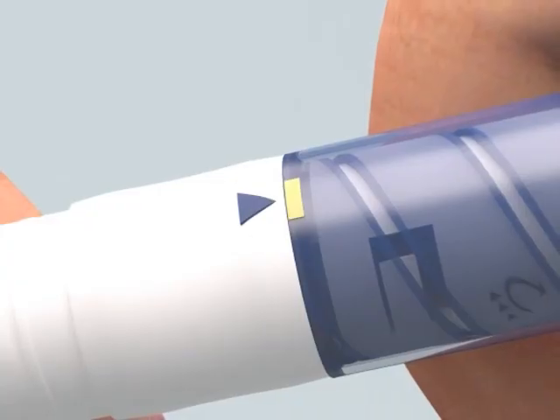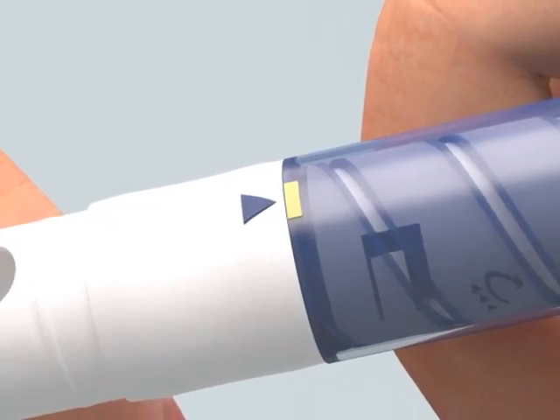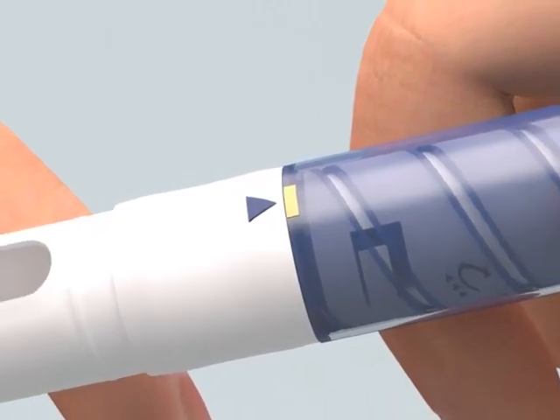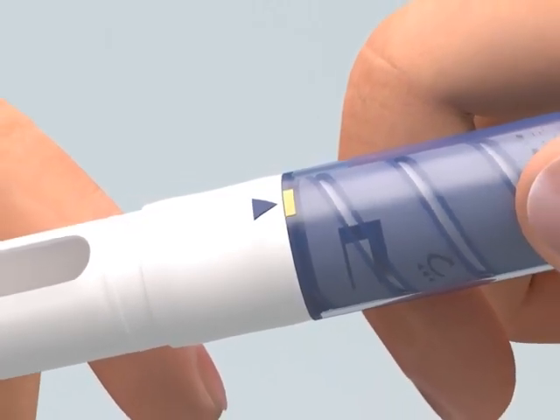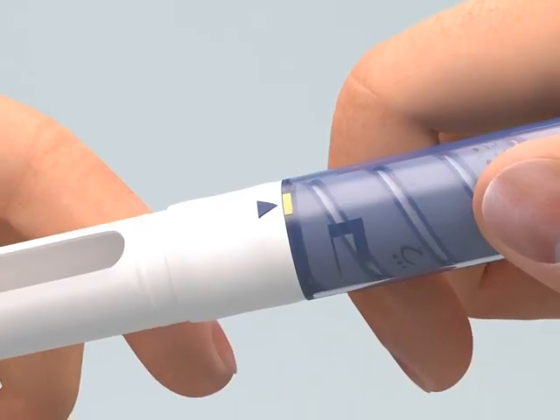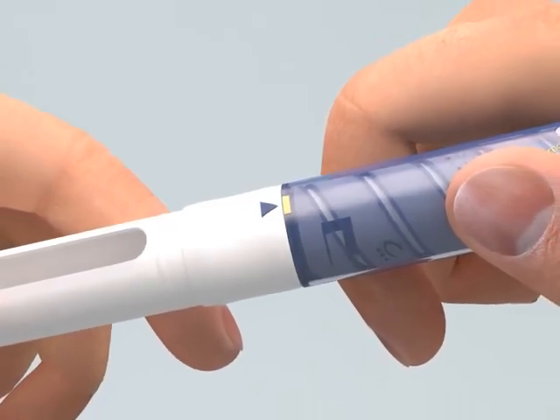Check that the cartridge holder is attached to the pen body with the blue arrow lined up with the yellow or white mark on the pen body before each injection. After the attachment of the pen needle, a few drops of medication may be observed.